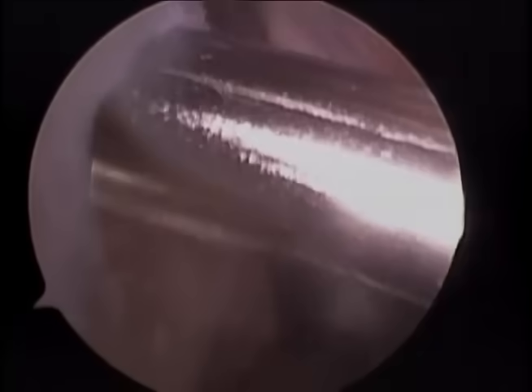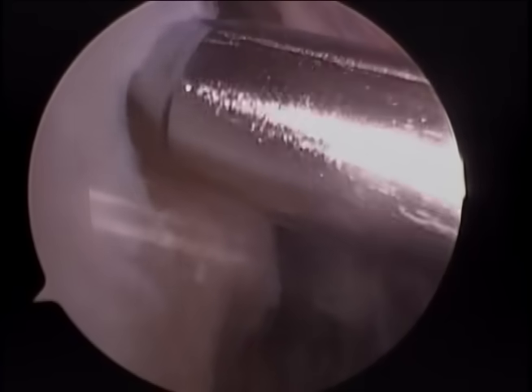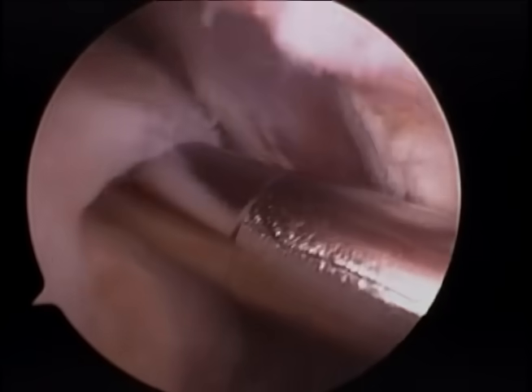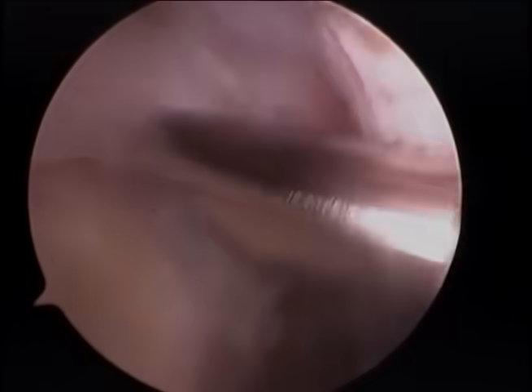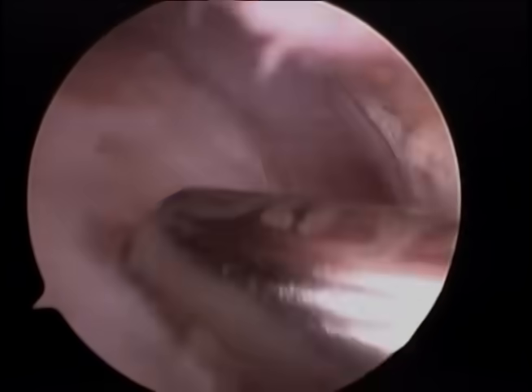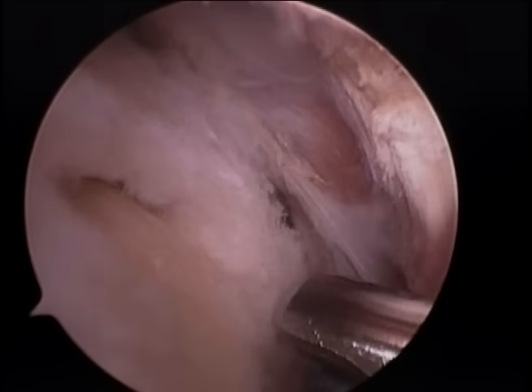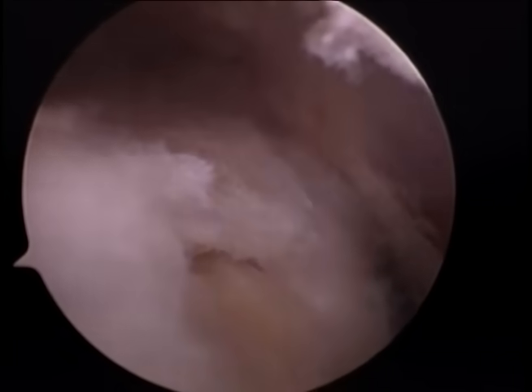We must then prepare the edges of the tear and the underlying bone for the rotator cuff repair. The shaver is actually inside the tear in the glenohumeral joint, and then lightly removing soft tissue from the underlying bone of the greater tuberosity footprint. We need a bleeding surface for the tendon to heal to. Here is a nice view of our 1 centimeter supraspinatus tear. The underlying yellow surface is the bone of the tuberosity.